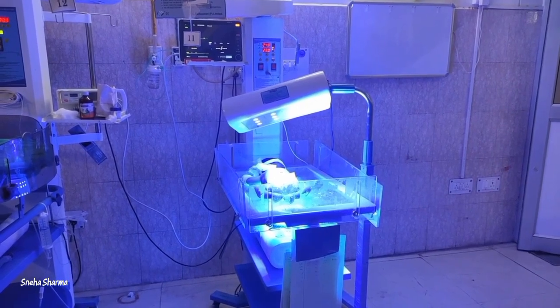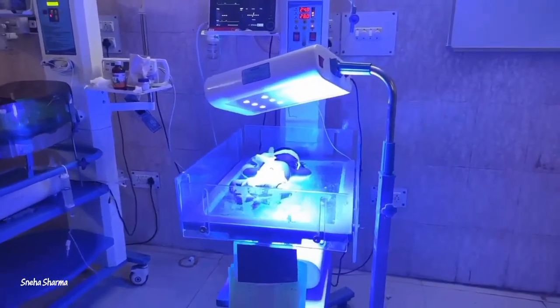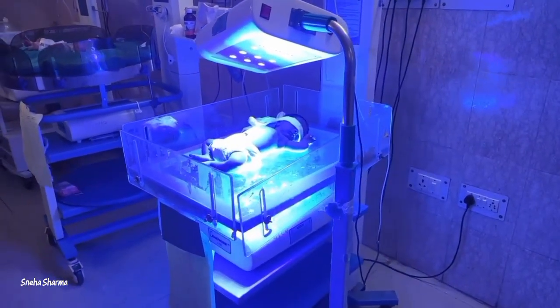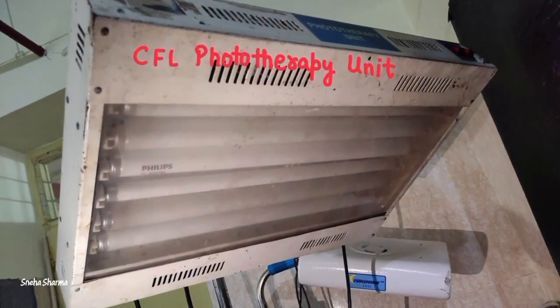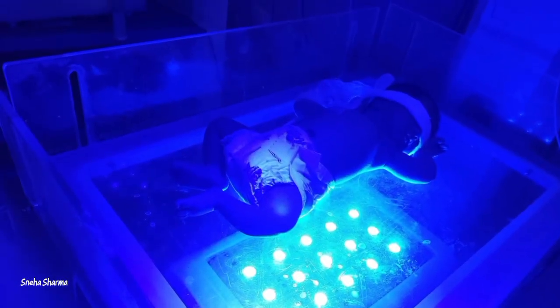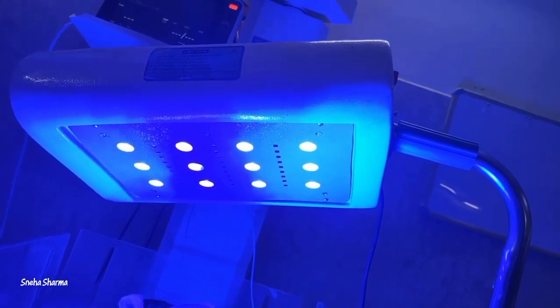Now, the phototherapy. It is a type of light therapy used to reduce the bilirubin level in the baby's body. It converts it into a water-soluble form and it is excreted out from the body. Phototherapy involves shining lights both below and above the body, and the bilirubin dissolves in fat in the body. The lights make it dissolve in water, and therefore it is excreted in the urine.